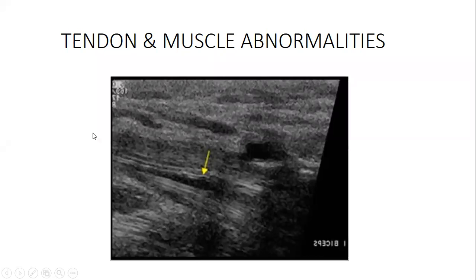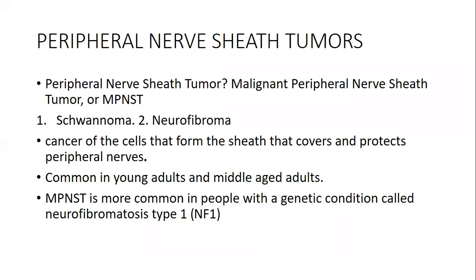So specifically, I wanted to show that within the band of the muscle or a tendon, you can have a rupture. I've seen quite a number of ruptures, things like the rectus femoris on the lower portion, on the thigh, quite significant, and you can actually see the detachment. And the detachment within the tendon and the muscle, normally you see the muscle and hypoechoic appearance. The question is, you really have to know exactly which portion and which structure you are looking at.